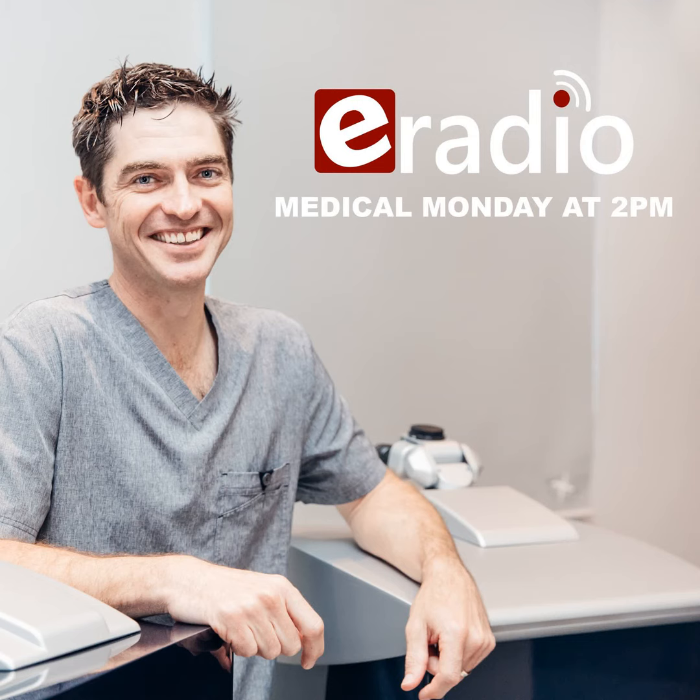And if 10% or 15% are not on target, we can do either a PRK at 6 weeks after their surgery, or we can do a LASIK at 3 months after their surgery as well, if they're a good candidate, to fine-tune their vision. So the alternative laser procedure, if you're not a good candidate for LASIK, is the PRK, or on our platform Streamlight, where the laser does the whole treatment itself.